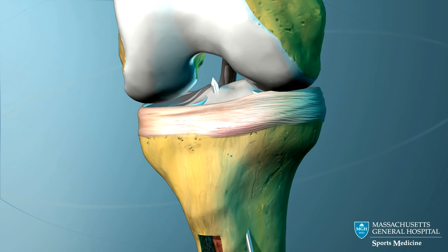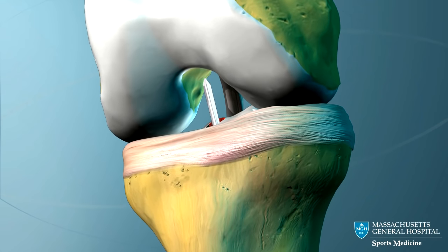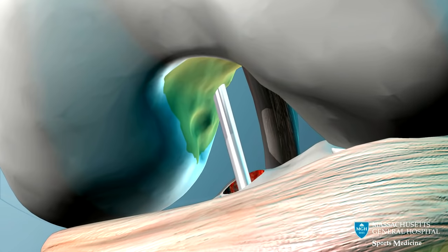The guide pin is now passed through the tibia tunnel and into the femur. It is drilled into the bone at the spot where the ACL normally attaches to the femur.